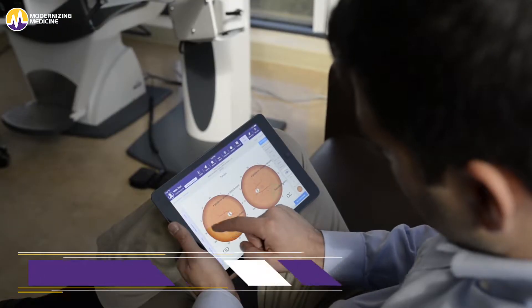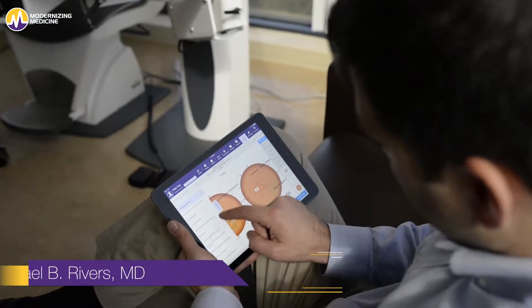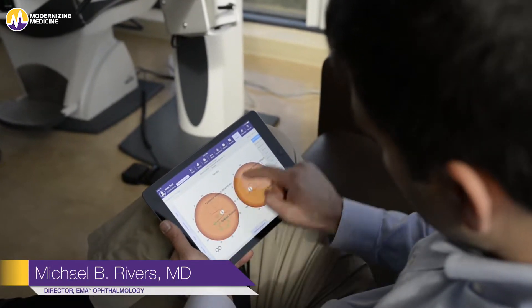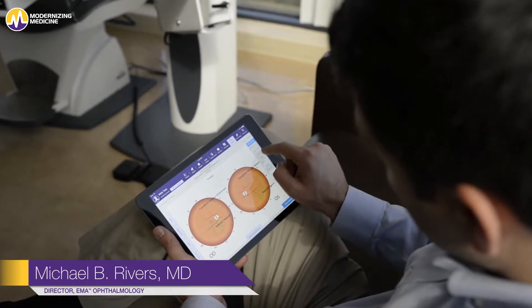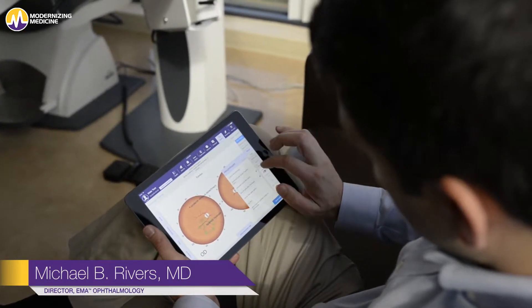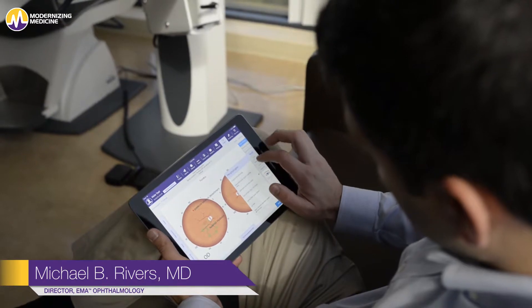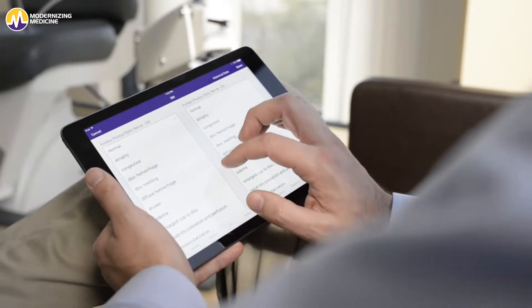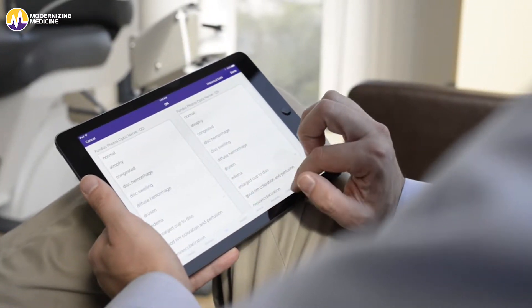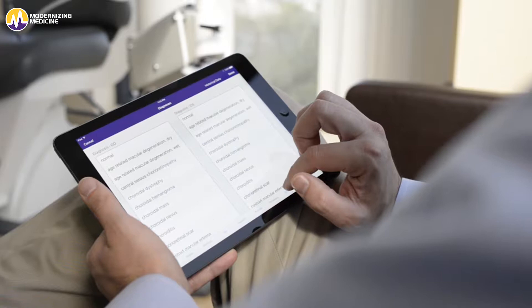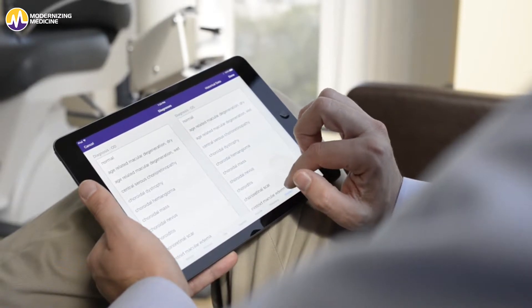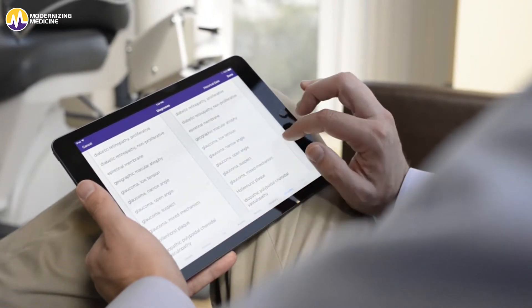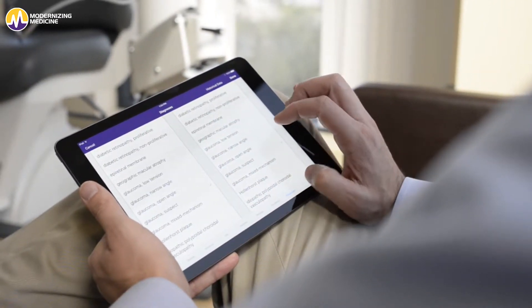Hi, I'm Dr. Michael Rivers, Director of EMA Ophthalmology at Modernizing Medicine. Today I'm going to show you how our EHR system, EMA, uses an adaptive learning engine, protocols, drawings, and automatically suggests coding to help you efficiently document a visit.